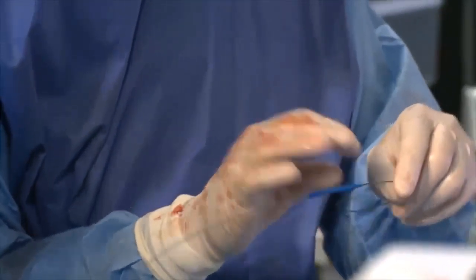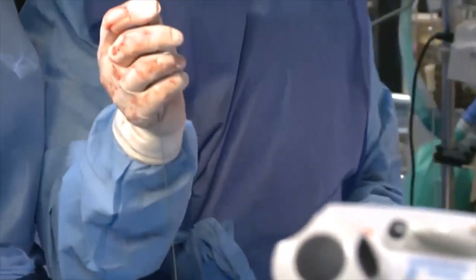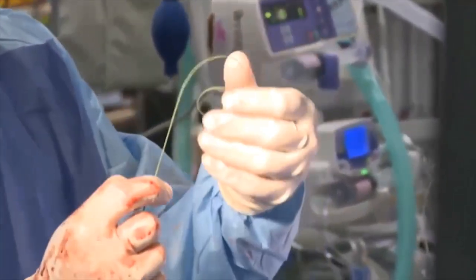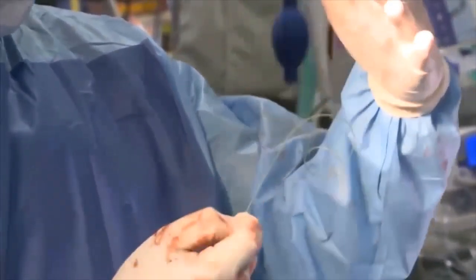So the important question is, whenever a patient has a low gradient aortic stenosis. What do you think, Ravindra? Is this okay? This looks good. Are we okay to go into this? Yeah. Let's go ahead and place the wire. The shape of the wire is important. That looks like it is not traumatic now.